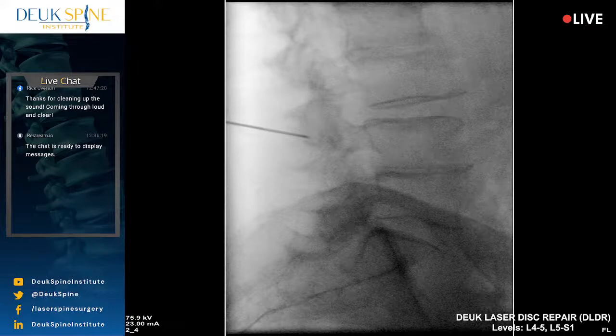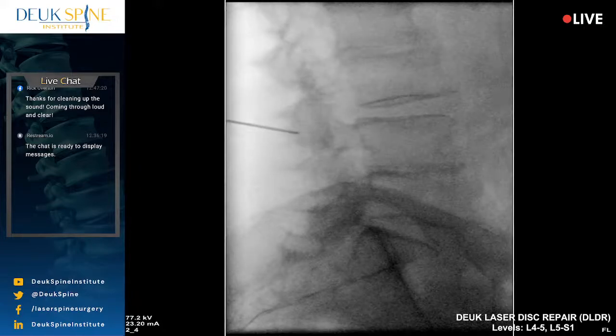All right, shot. Let's get some numbing medicine. We're going to give her a little bit of local.